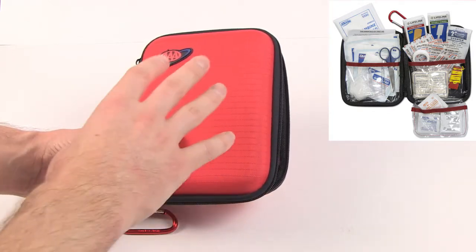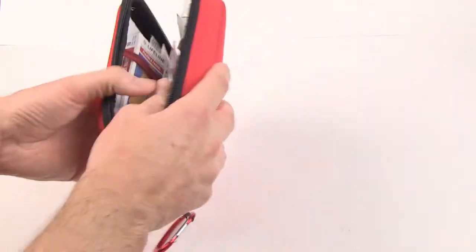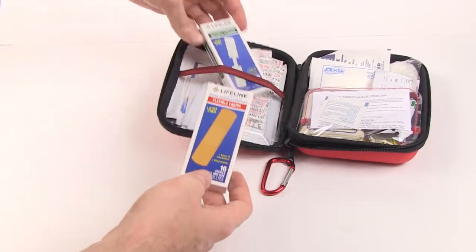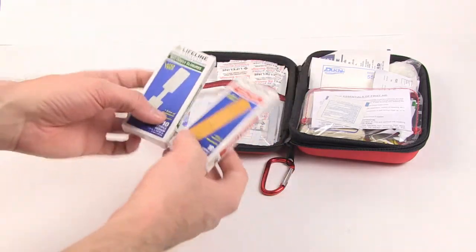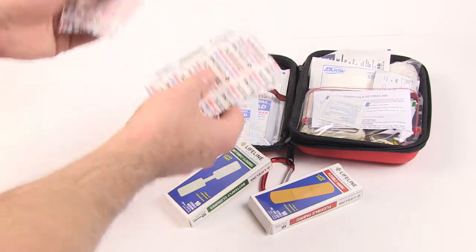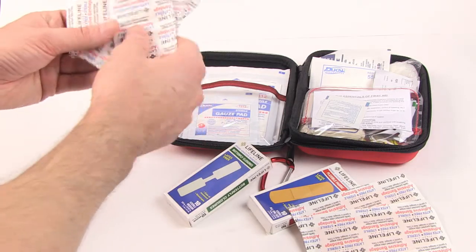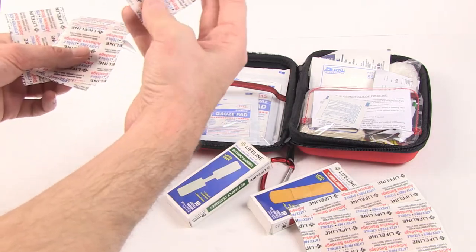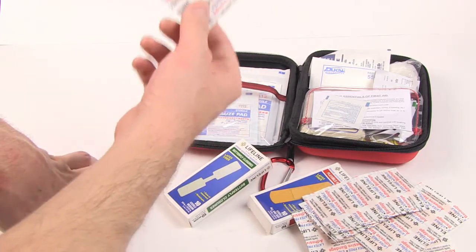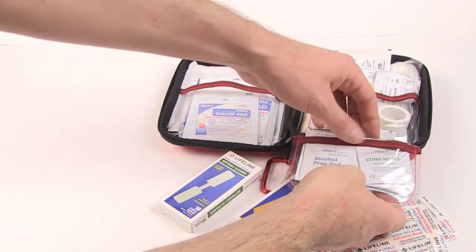Okay, so now I'll get into the contents of the kit just real quick and show you what you would use the different things for. All right, first off, you have your bandages, 10 each. You got your butterflies and just your regular bandages for small cuts. And then you got 3 different kinds of bandages here. You got your extra large ones for bigger cuts. And then you got your tiny little ones. These are little thin strips. And then you got your butterfly bandage, which these are used for short and deep cuts to kind of hold them together.